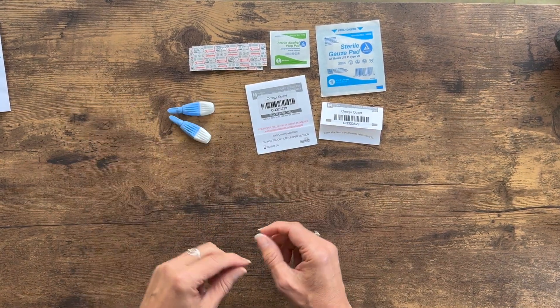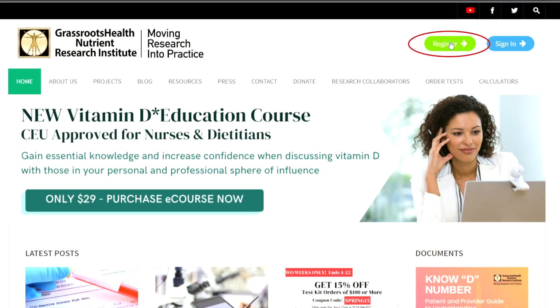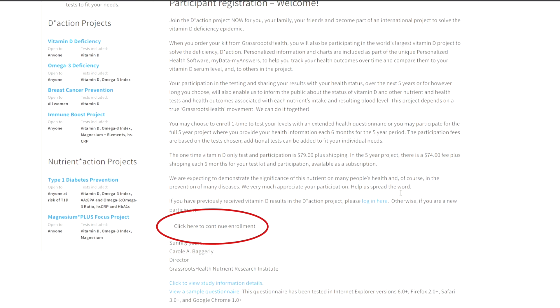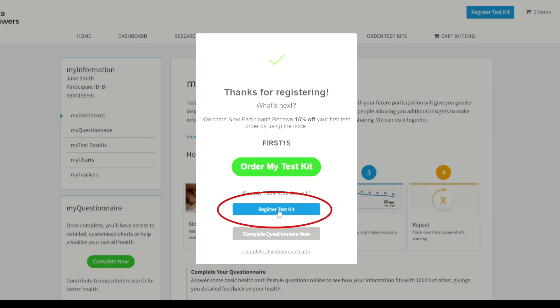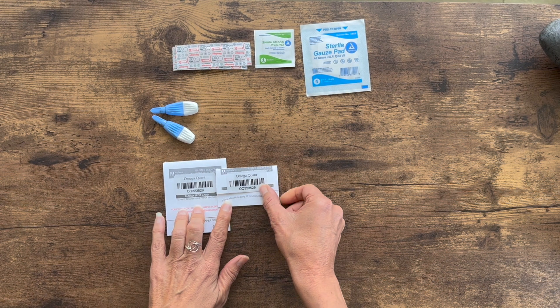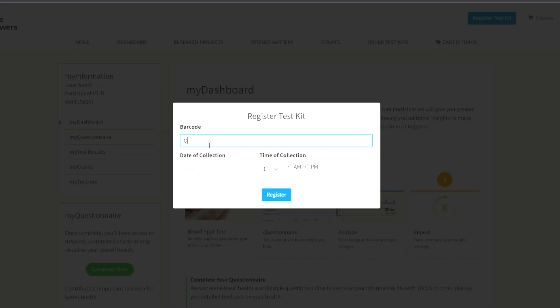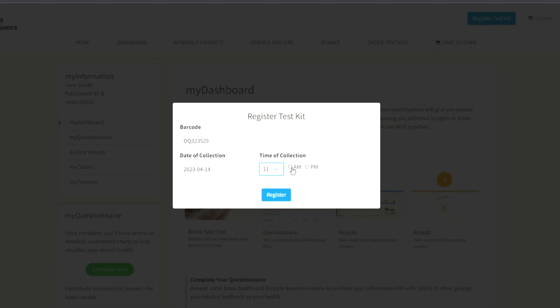Before taking your blood sample, log into your account at grassrootshealth.net or register for a new online account and enroll into the project. To register your test kit, click the Register Test Kit button on the website. Enter the barcode along with the date and time you are collecting your blood spot sample, and click the Register button.